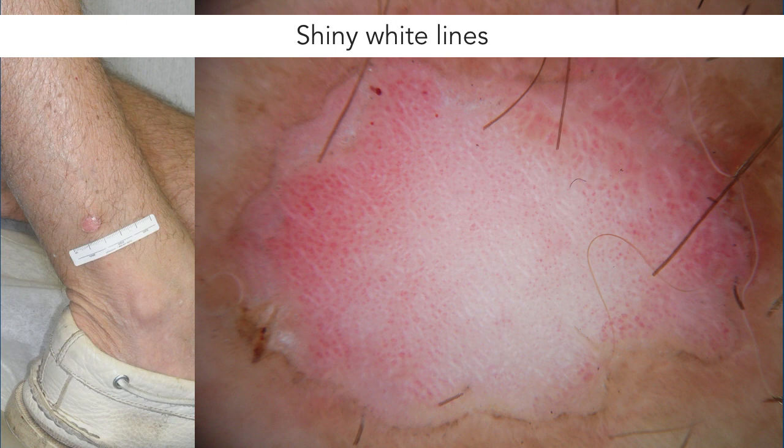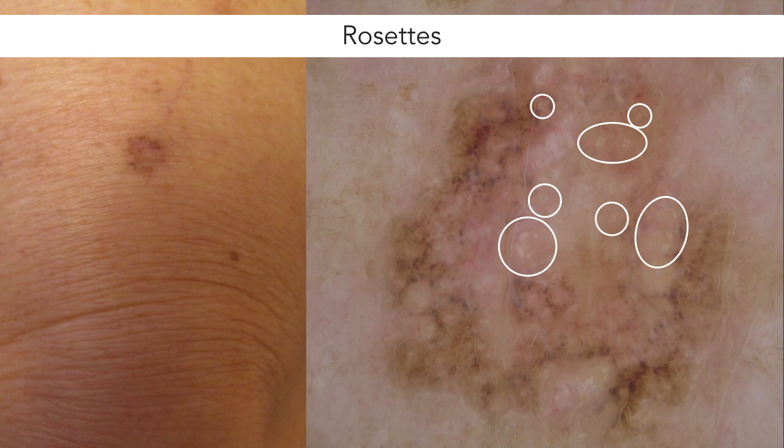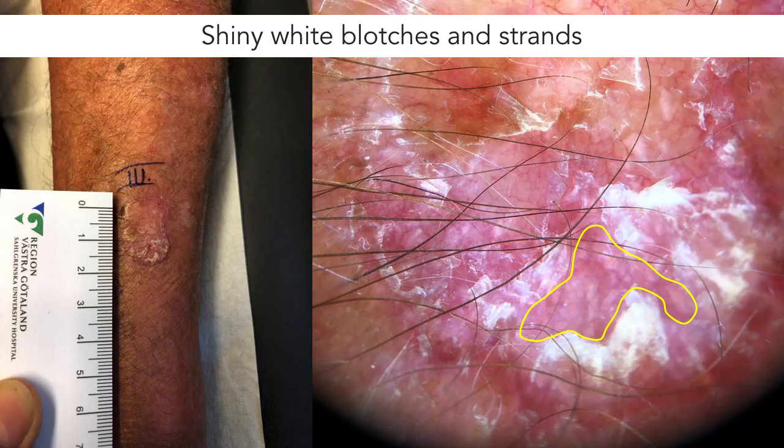This is a beautiful solitary porokeratosis lesion with several interesting features. We see a pigmented keratin rim and widespread dotted vessels, but there are also abundant shiny white lines intermixed with the dotted vessels. In this pigmented porokeratosis, we can find a few rosettes of varying size within the central area, highlighted with white circles. In this rather large porokeratosis, we see lots of features including shiny white blotches and strands within the yellow demarcation.